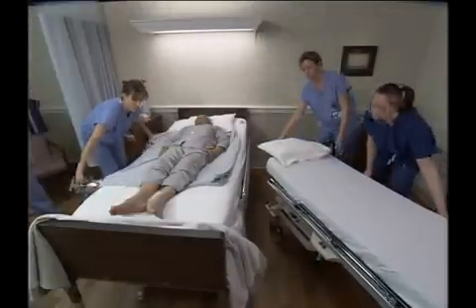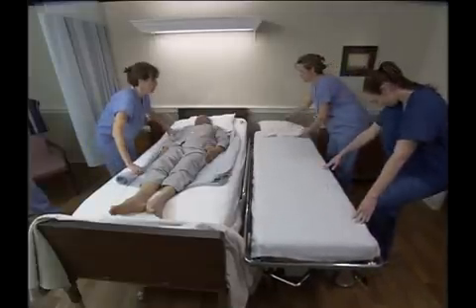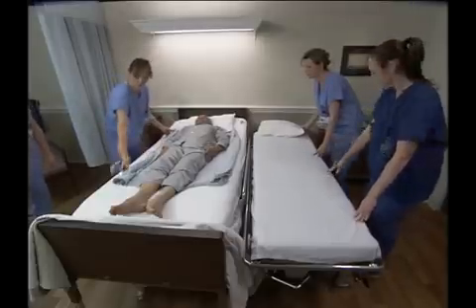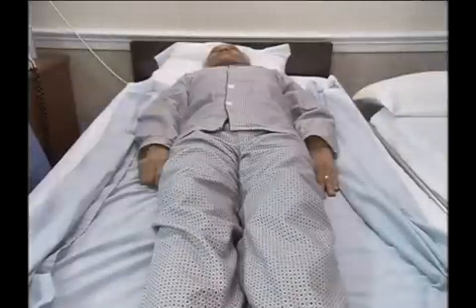Position the stretcher alongside the bed. It should be slightly lower than the bed. Lock the stretcher wheels. If stretcher safety belts are in use, move them out of the way. Make sure the lift sheet is positioned so that it is under the person's shoulders and hips.